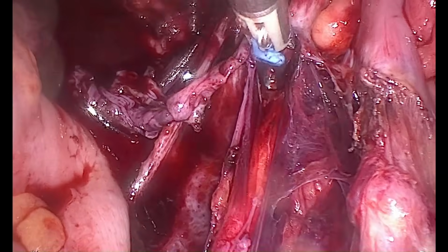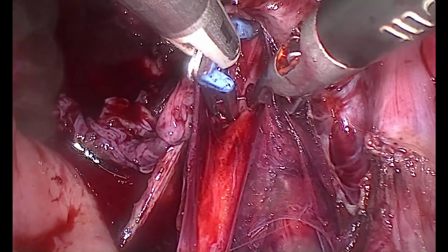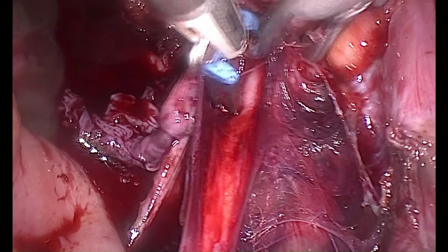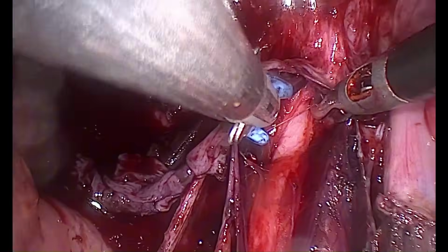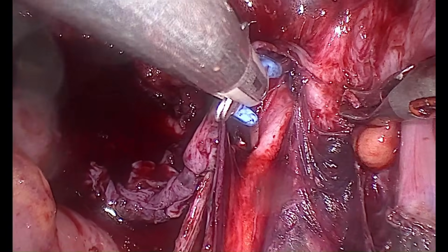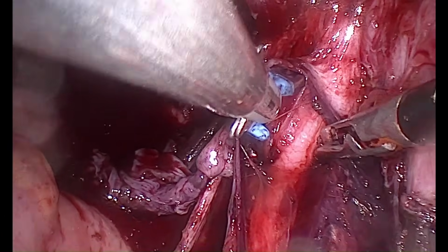So once this dissection is carried out one by one, millimeter by millimeter, you are going to understand that these are the fibers which are fibrosed out there, and this is the parametrial disease of the endometriosis. And once the parametrial disease is cleared out, this patient usually, if having good AMH, has a good fertility outcome after the surgical excision of the endometriosis.